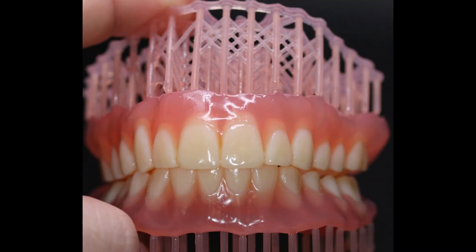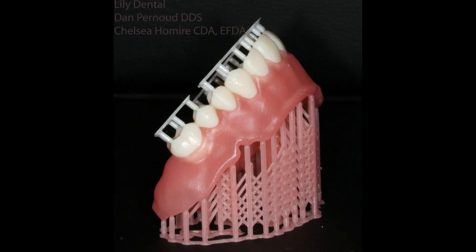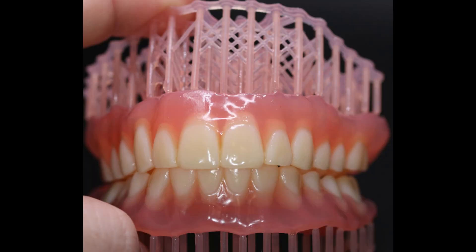Hey guys, Chelsea Holmeyer here. I just wanted to show you a quick video of staining and glazing some of these immediate dentures that we made. They are made out of Denka Original Pink Base. There they are printed with the supports on them — I do like to leave the supports on the base itself. We're going to be turning it into that beautiful guy.